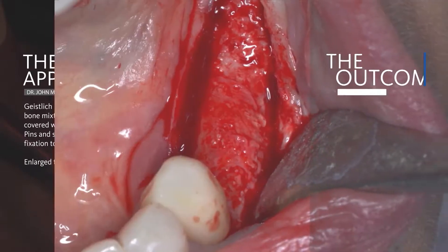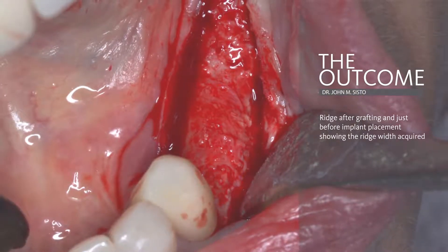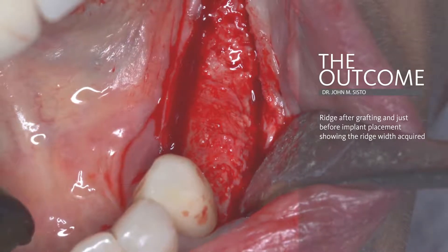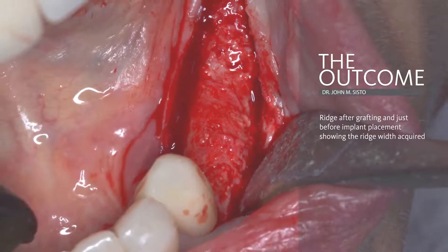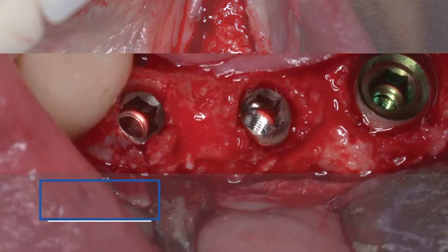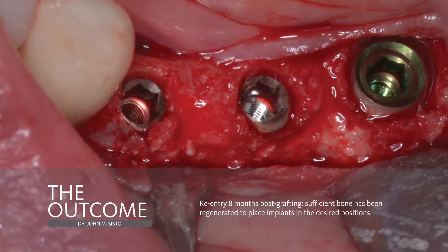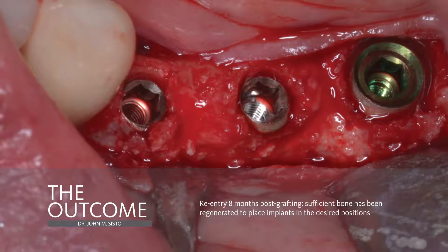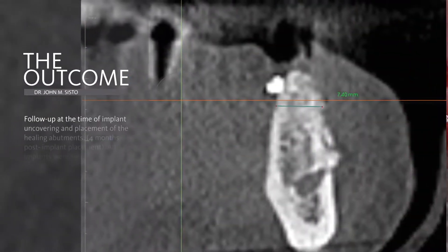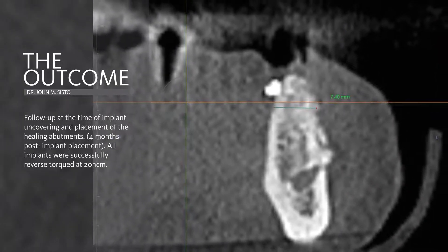After eight months of healing, a dense, wide ridge was developed to accommodate three implants. A virtual wax-up was made that was custom to the patient's occlusion. This makes the crowns very accurate for implant placement. At the time of placement, all three implants achieved an insertion torque of greater than 50 newton-centimeters. A coronal slice in the area of number 20 shows excellent ridge width obtained with this technique.